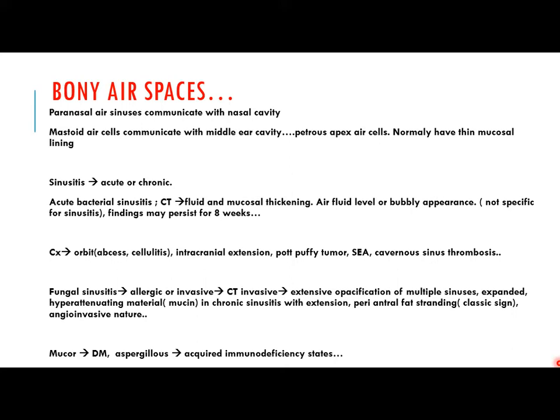Sometimes when we have many cases in the CT department, we see it and we say this is sinusitis. But when we see the patient has no symptoms at the current time, it means that this may be a previous finding, because the sinusitis findings persist up to 8 weeks.